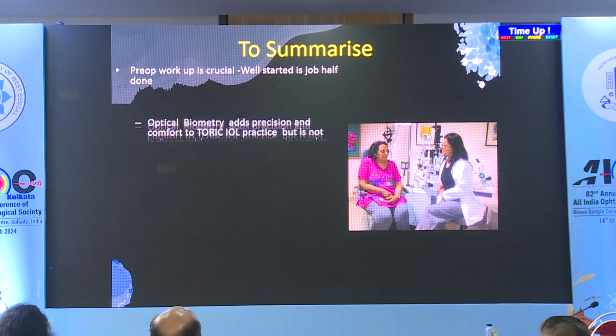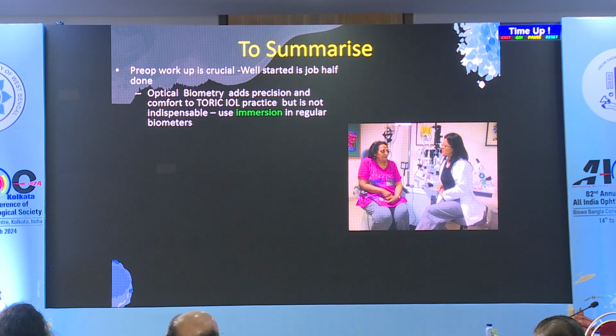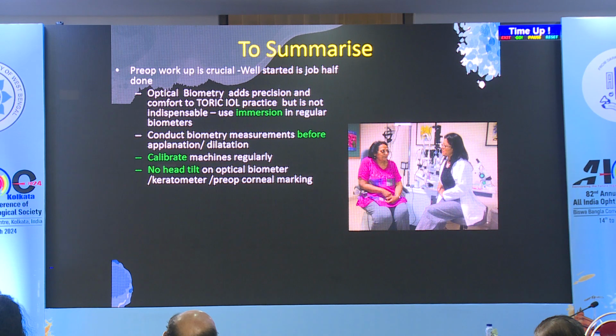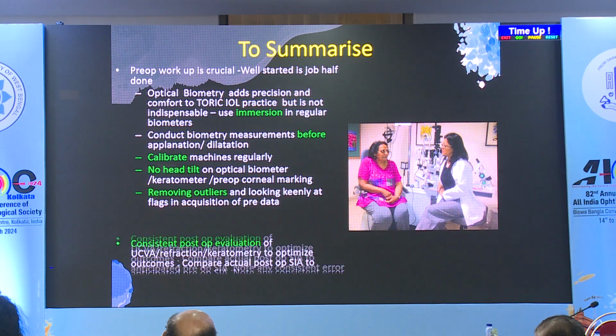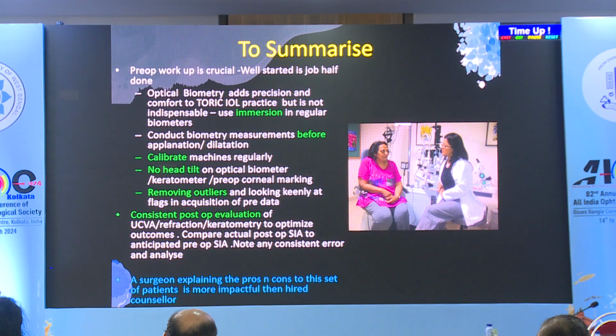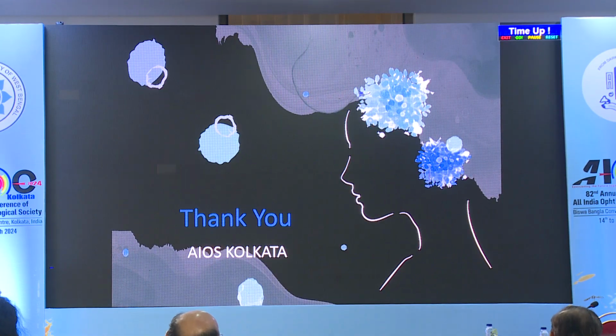So just to summarize, the pre-op work is very important. I think we've highlighted how OSD and dry eye can be treated. Immersion is as good, even if you don't have optical biometers. Make sure that your machines are calibrated well. Head tilt is very important. Removing outliers, a consistent post-op evaluation of your cases helps in refining your toric IOLs, and talk to the patient more, explaining to him what the expectations are and what you're going to do.